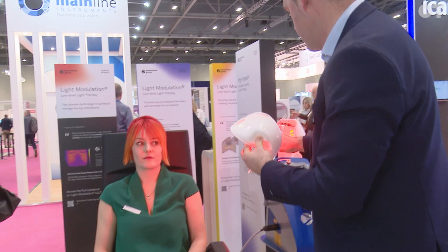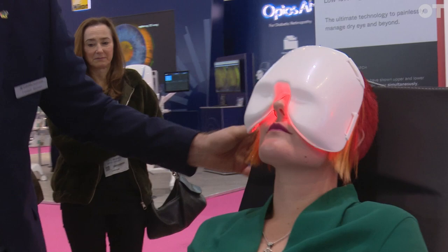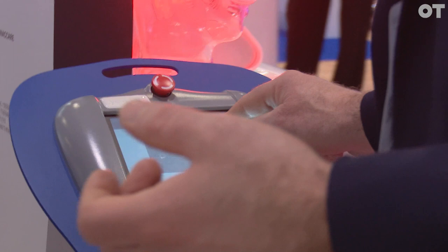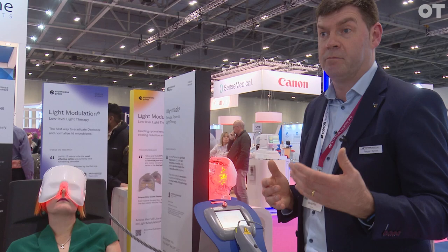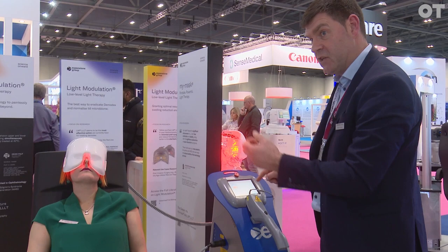So I'll just put this mask on Danny here. We'll recline the chair to about 45 degrees to make sure the patient is in a comfortable position, and then we start the treatment. We choose the severity of meibomian gland dysfunction that the patient has, normally graded on a scale of one to four, which is the Heacock scale. We normally get that information by doing meibography, which is imaging of the meibomian glands. So in this case, Danny is a grade one — not very severe dry eye. We select grade one.